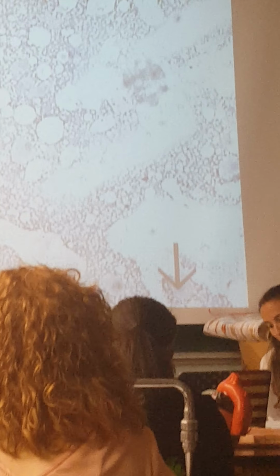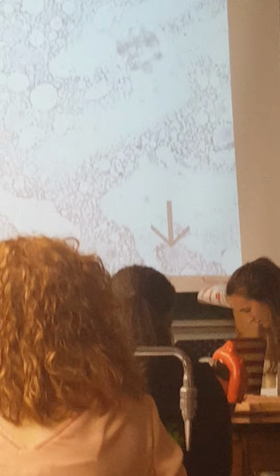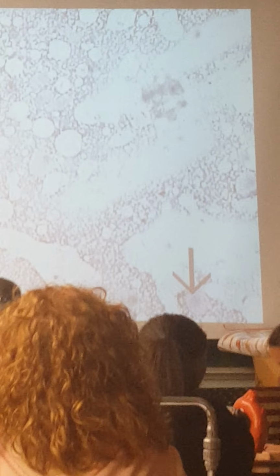So, again, we can see a lot of the red marrow. This is where white blood cells and red blood cells are made. Oh, there it is. That's a megakaryocyte. It's mega. It's huge. These are blobs of fat. That's a megakaryocyte, and there's another megakaryocyte. These are the structures that break apart and become thrombocytes or platelets. Mixed in here are red blood cells and white blood cells.